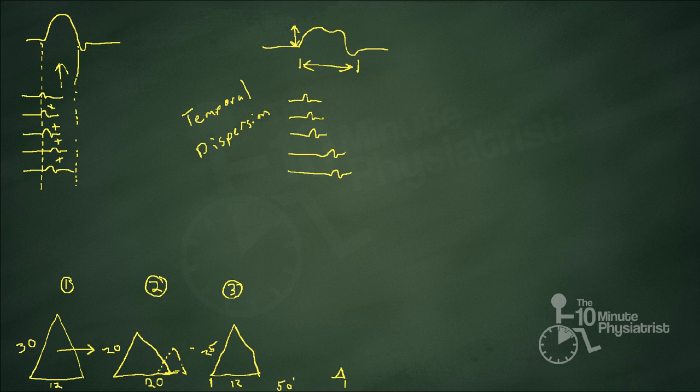In the final case, you could imagine if these 2 potentials acted more like case 3, where they walk over to the other side of the plaza. I won't draw those out, but just imagine I pulled both of these potentials even further off to the right and separated them out. In that case, what we would get is something that might look like this. Again, we've shortened our pyramid, it might have more of an irregular shape, and then we have two renegade acrobats that are now way out to the side here and form their own little potential. That's far enough out that it has separated from the parent potential altogether, and this phenomenon is typically called a linked potential or a satellite potential. So those are some basic principles of electrodiagnostic recording of potentials.